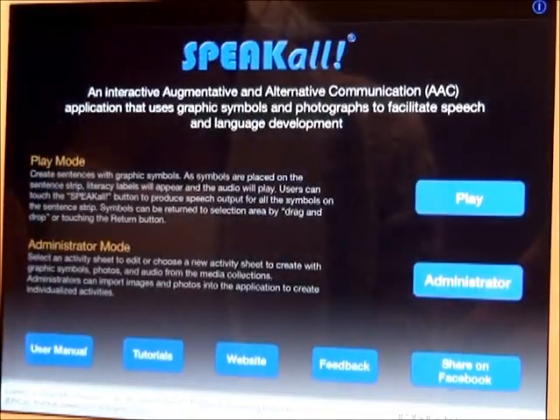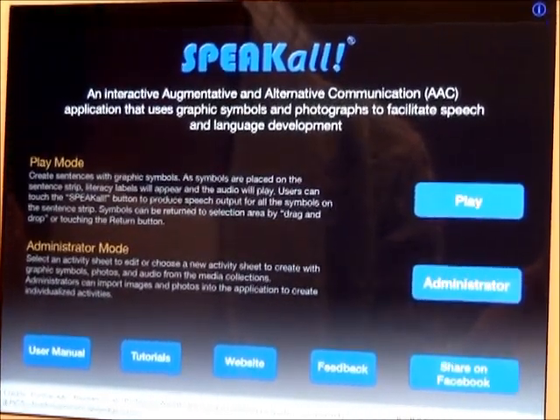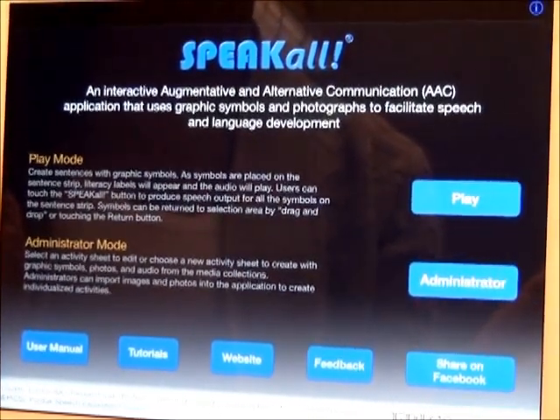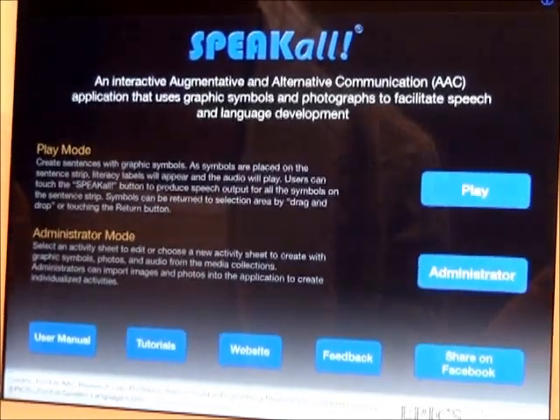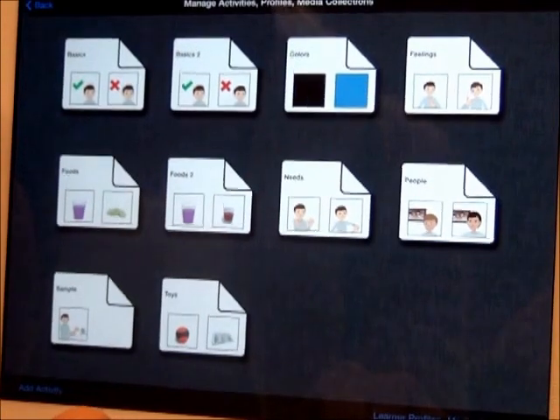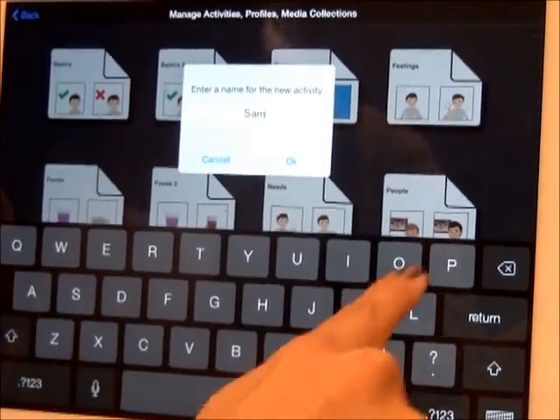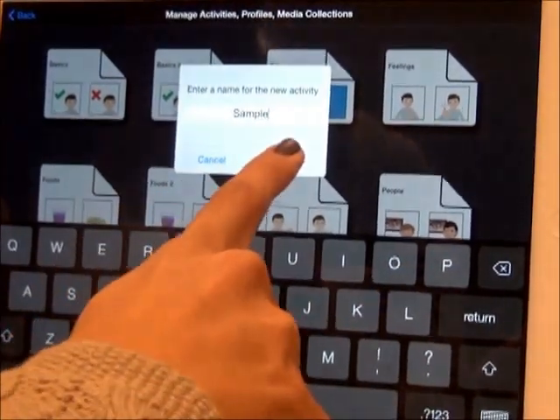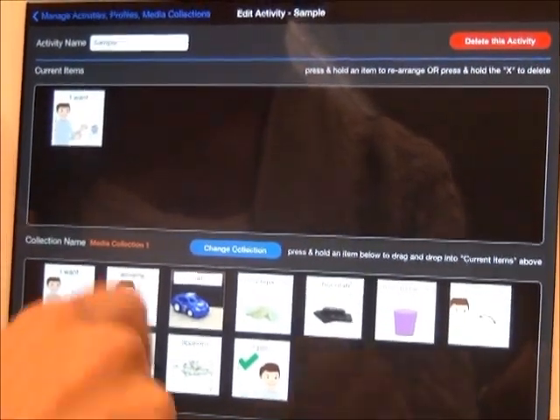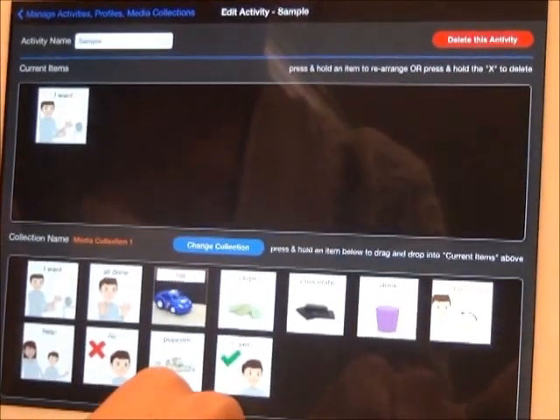Now I will show you how to add activity sheets. With the free version of Speak All, you are limited to two activity sheets. Upgrade to the premium version for an unlimited number of activity sheets. From the home page, select Administrator, then press Add Activity in the lower left-hand corner. Name your new activity sheet. You have the option to rename or delete it here.